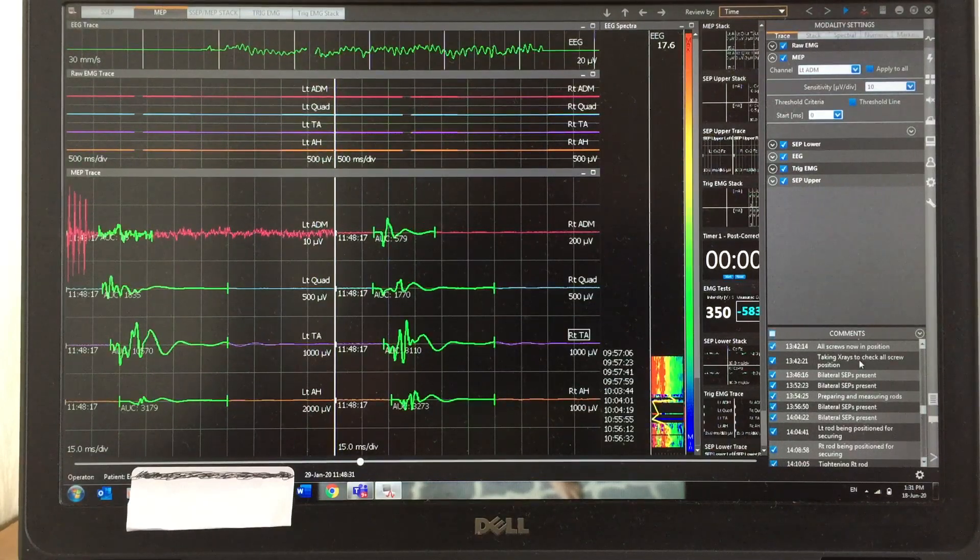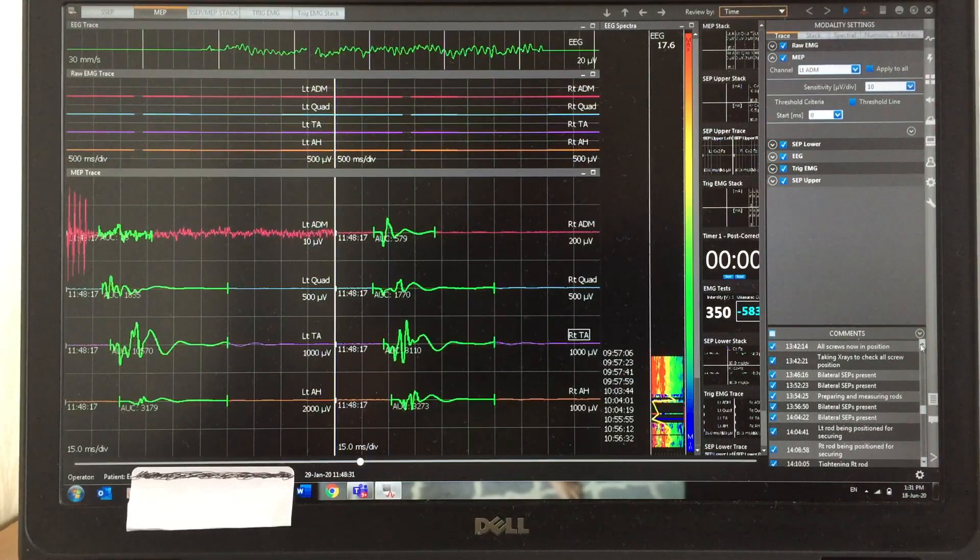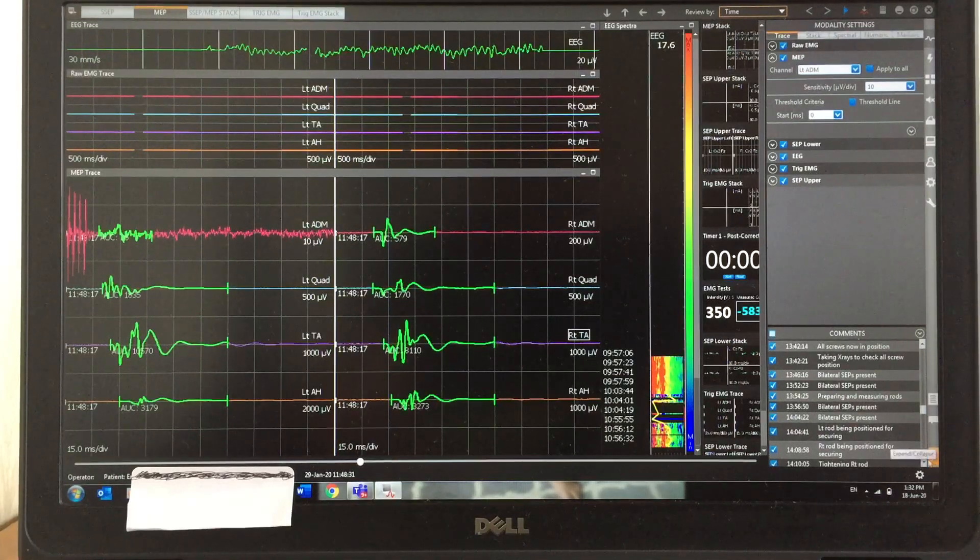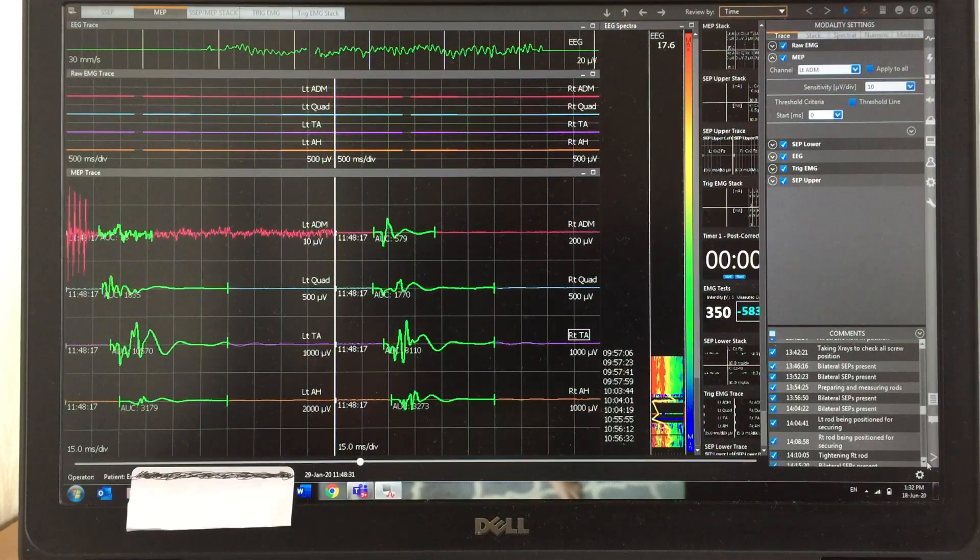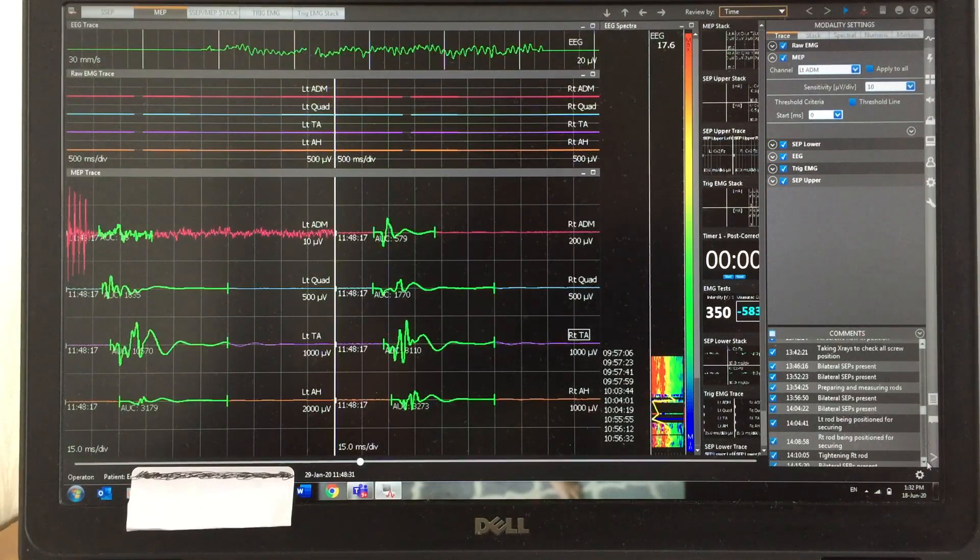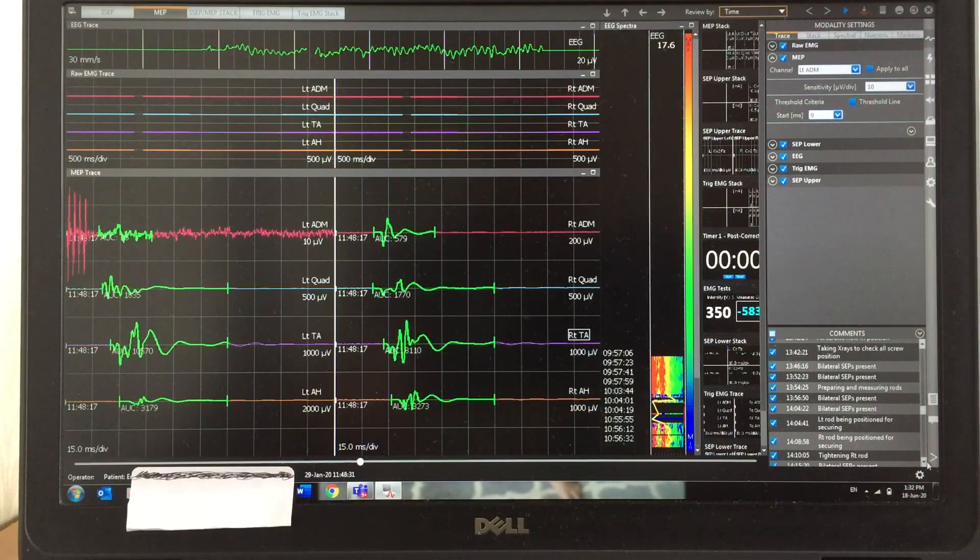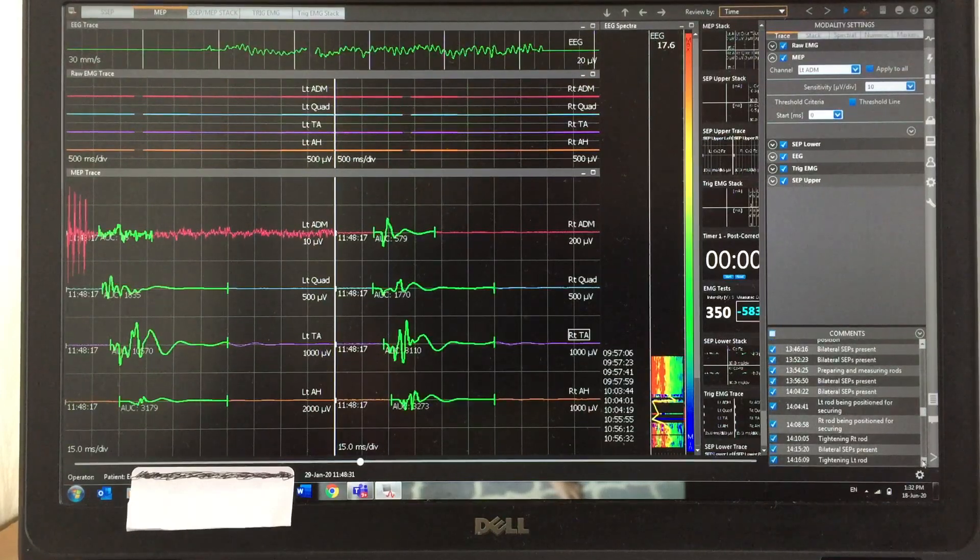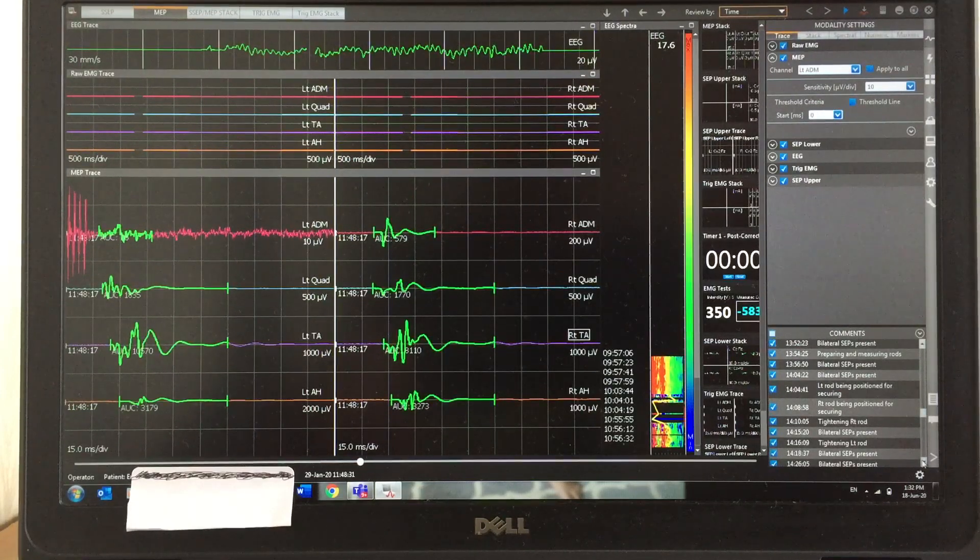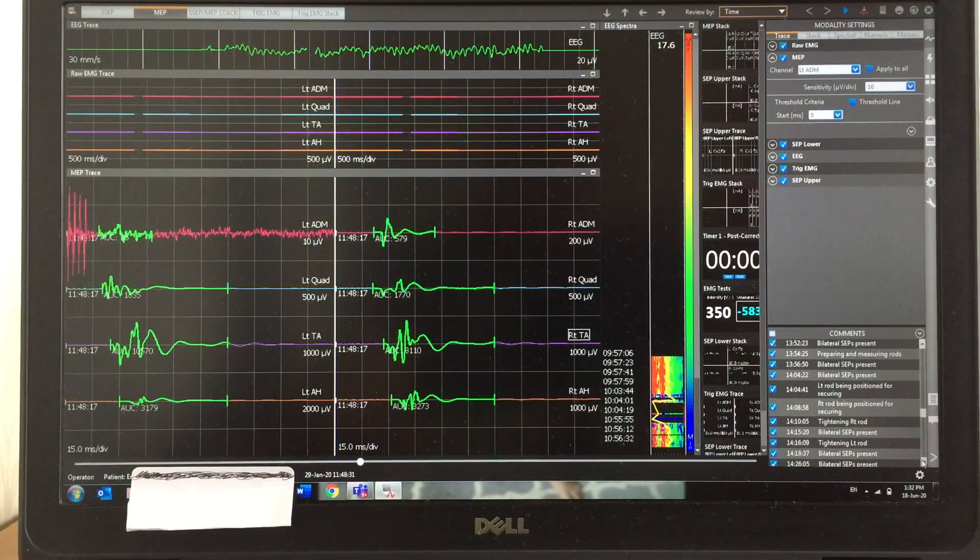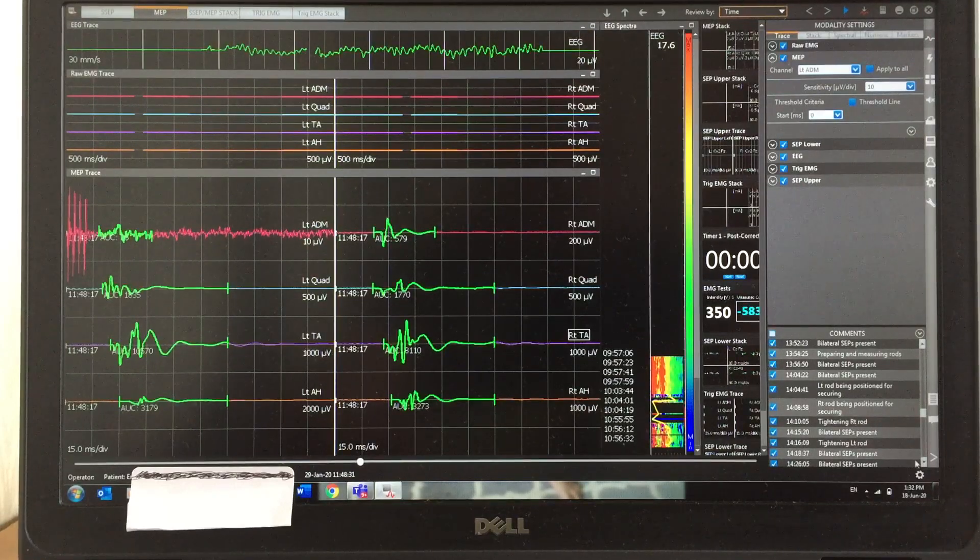During this time I usually take MEP responses. After that, each and every stage—inserting the rod, tightening the rod, bending the rod—all different stages I'm taking MEP responses. During this time I'll run the ACP continuously. There you can see tightening the left rod.